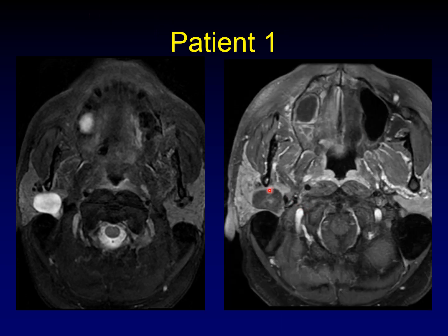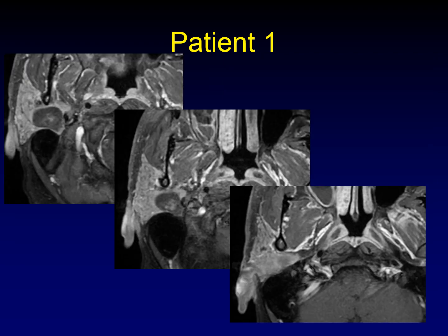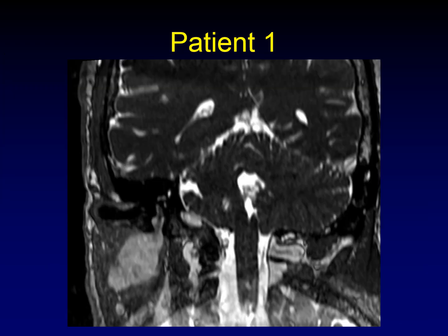Patient 1 has a heterogeneous enhancement pattern with ill-defined enhancement centrally. On these sequential images, you can really see the relationship of the lesion to the stylomastoid foramen. You can see the lesion start to knuckle in here, and here it is completely filling the stylomastoid foramen, and now you can see its effect on the vertical segment of the facial nerve. This is a steady-state free precession sequence in a coronal oblique view, and again, you can see the relationship of the mass to the stylomastoid foramen and vertical segment of the facial nerve.